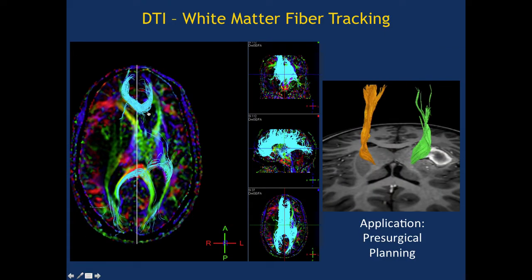So you get a sense of not only how organized it is and how anisotropic it is, but what the direction of that is. So that now we can do fiber tracking, which is connecting the dots of this directionality that we've collected in a DTI scan. And you can imagine these fiber tracks, which are really synthetic. They're not the actual images of actual fibers, but they are indicating the level of directionality and where those fibers are going. And you can imagine that this would be quite valuable to a neurosurgeon who's planning his approach to, say, affect this tumor.